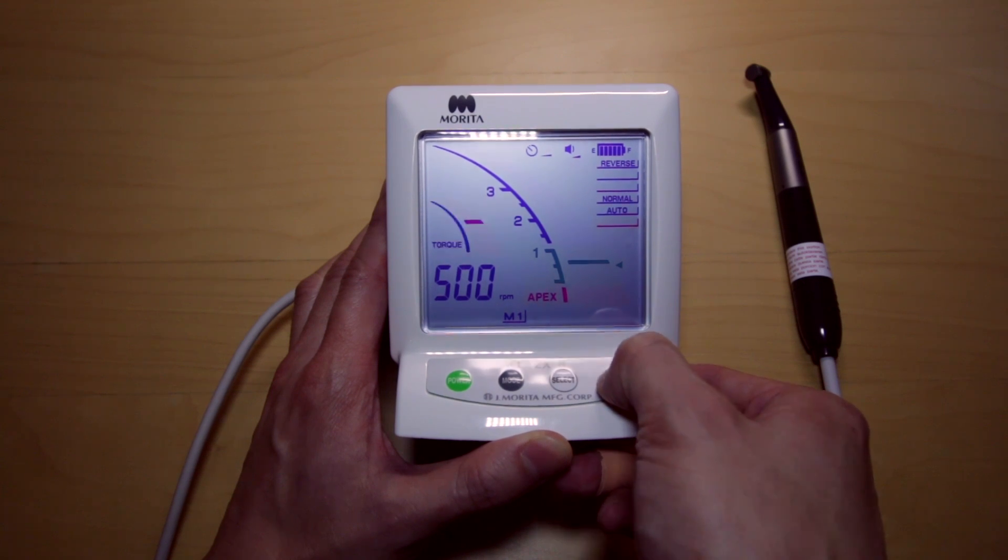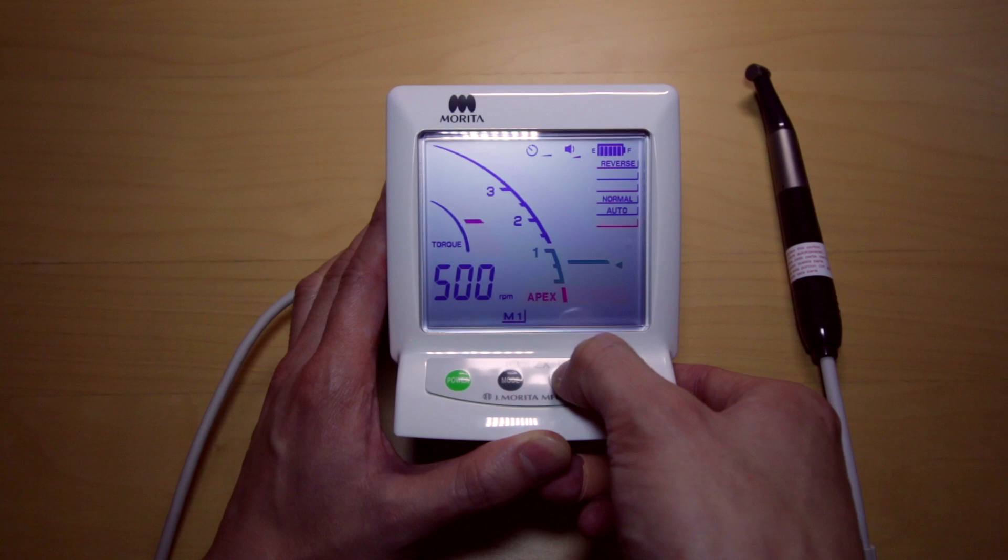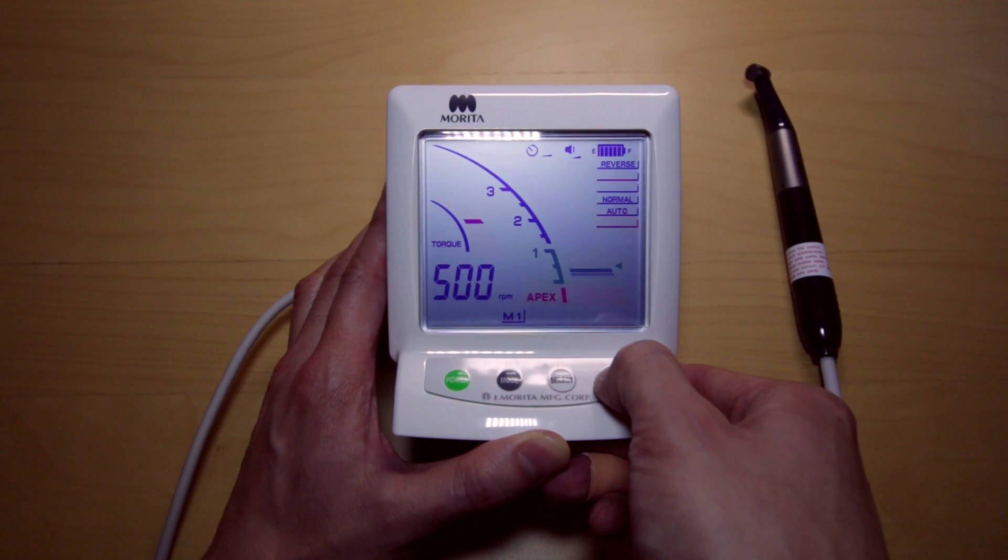The great thing about this device is you can use them separately, but if you want to use the apex location and the rotary at the same time, I would recommend lower torque levels, shorter apex values, along with slower RPMs.